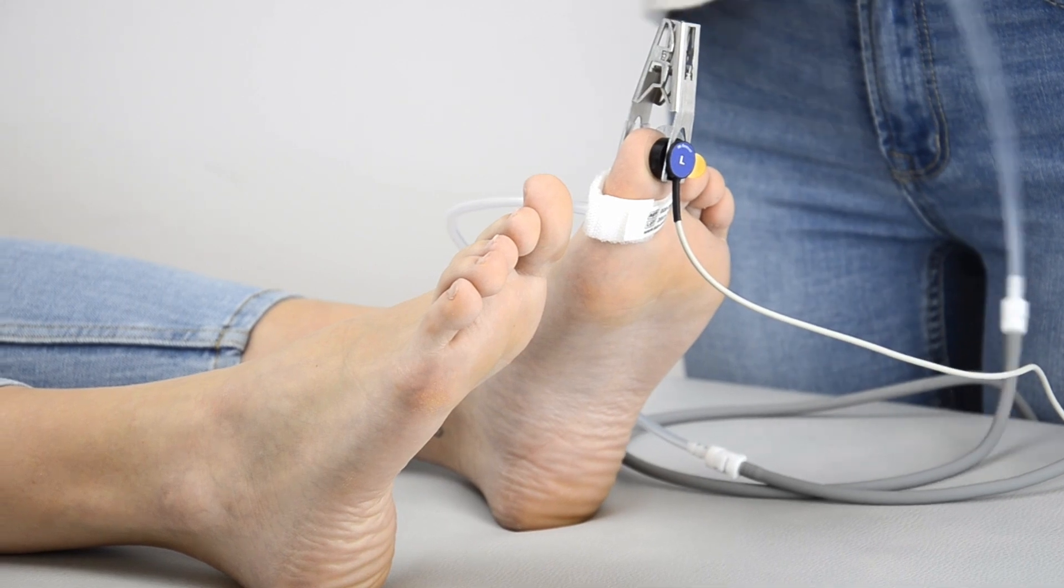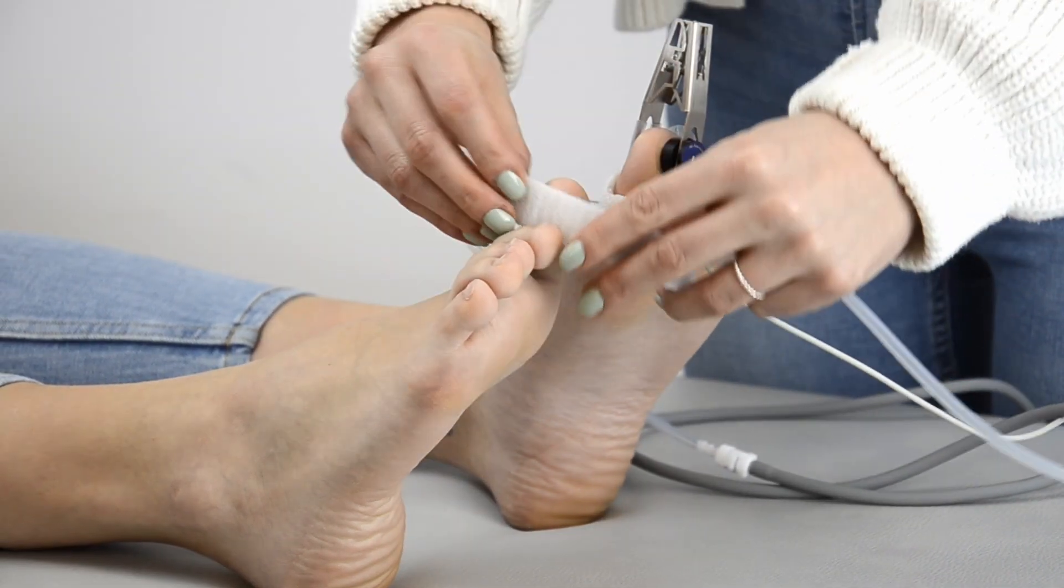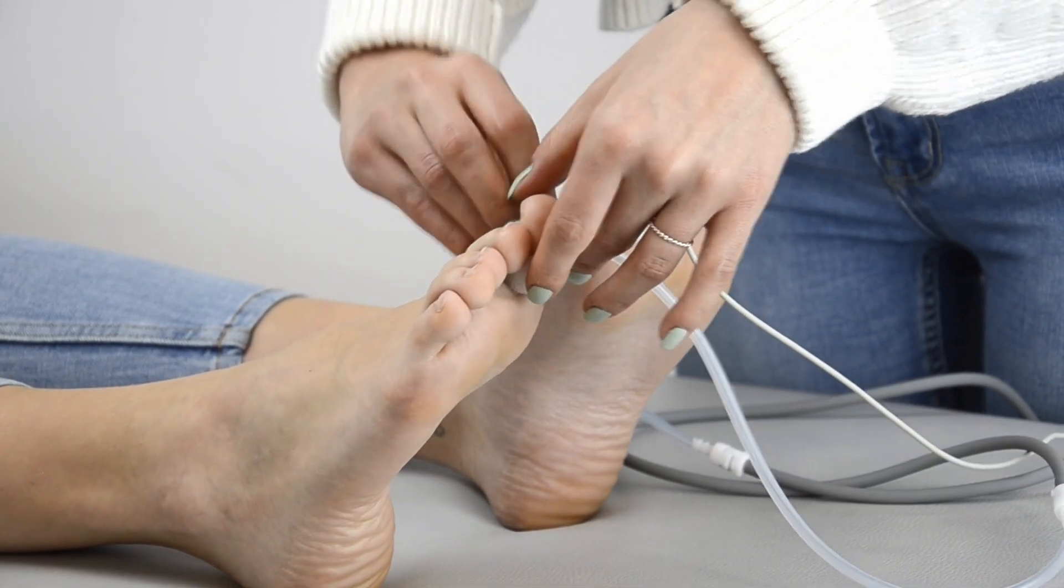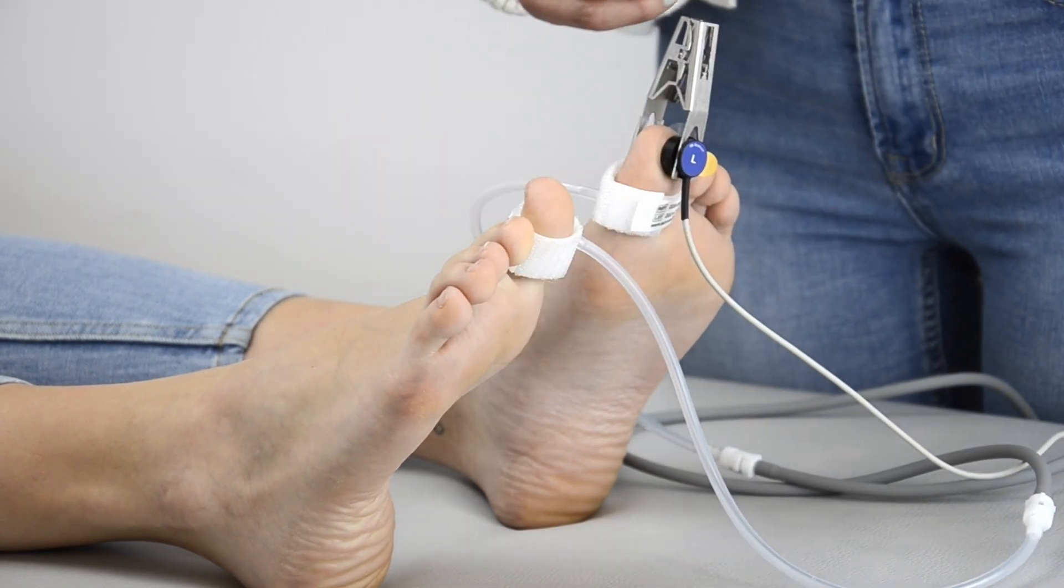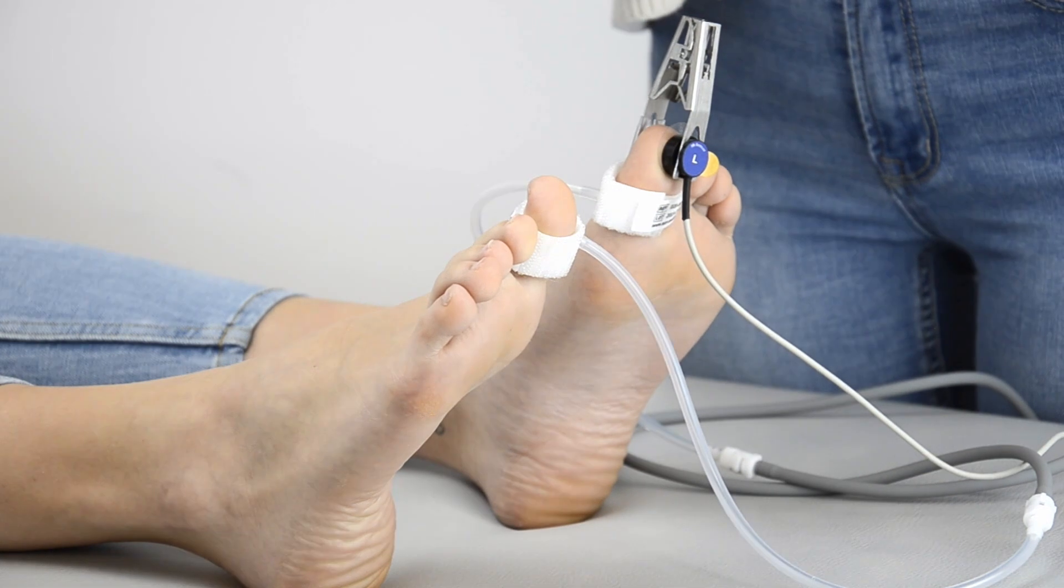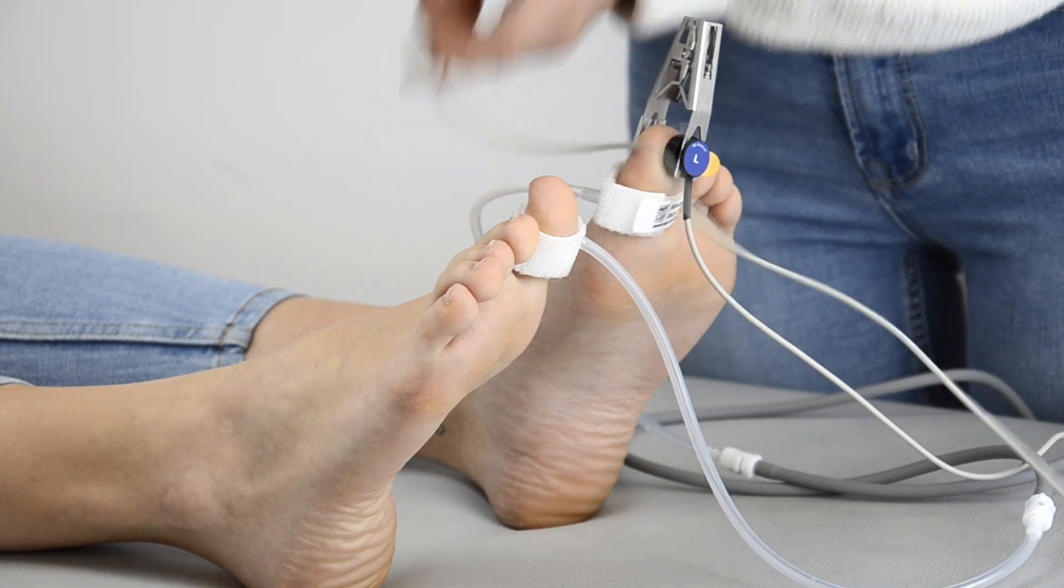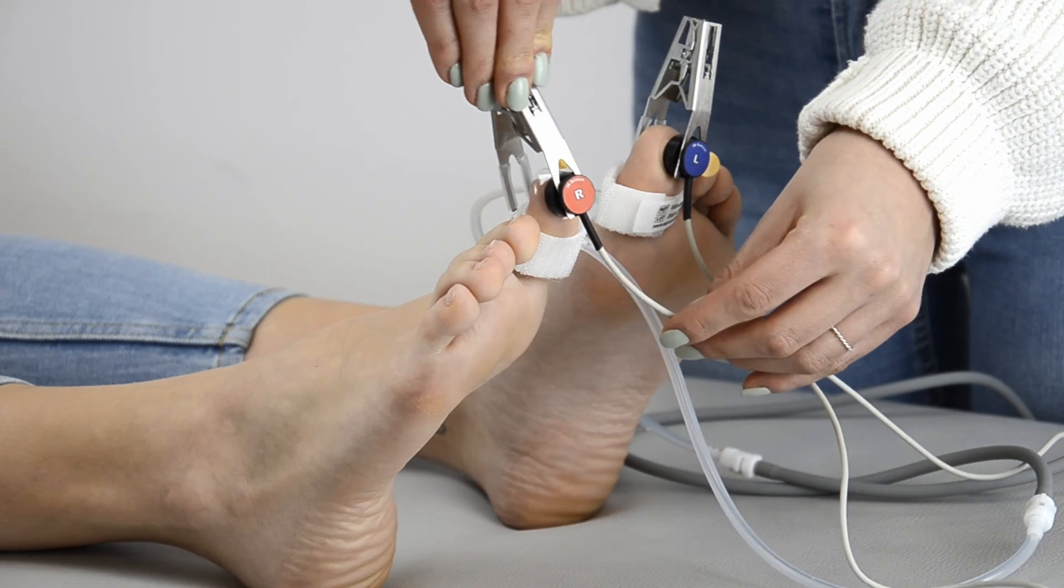Attach the toe cuffs and the sensors to the toes as you can see it in the video. Be sure that the toe cuffs are not placed too tight around the toes. Make sure that the sensor has full skin contact.